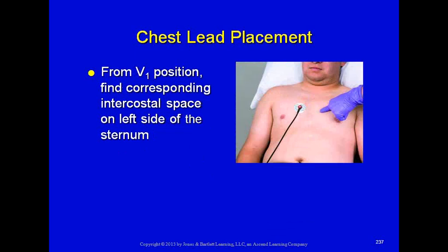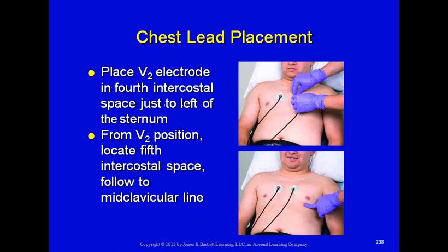So V1 corresponds with the fourth intercostal space on the right side of the sternum. That's your left, not the patient's left. V2 is in the fourth intercostal space just to the left of the sternum, the patient's left.